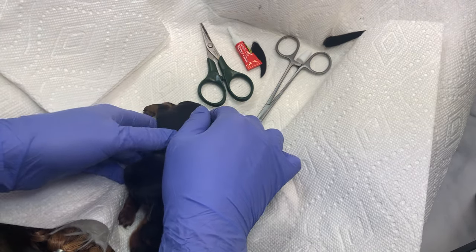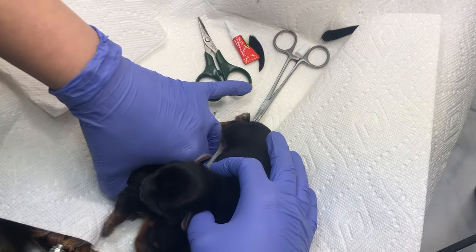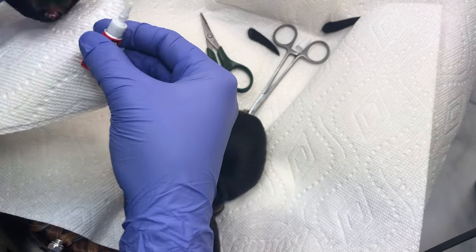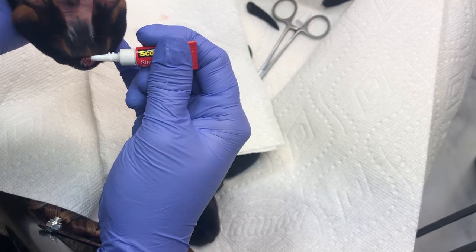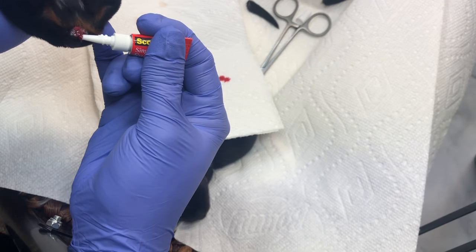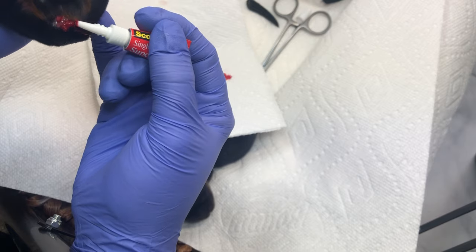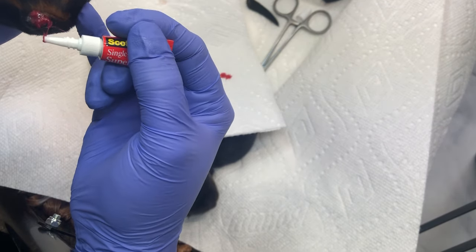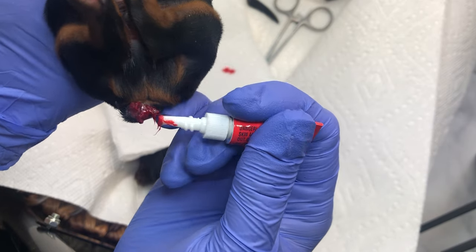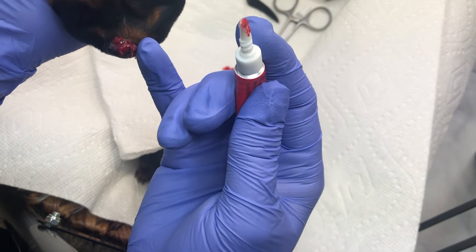Give it a minute — don't just wrap your stuff up. If the puppy is going to start getting some blood out of this super glue, you'll be able to tell pretty quick. I've got one little blood spot right there coming through — two spots. I'm just going to dab that. It makes kind of a little hard spot, but it stops the bleeding and just makes a nice little hard scab that will pop off in a couple weeks.